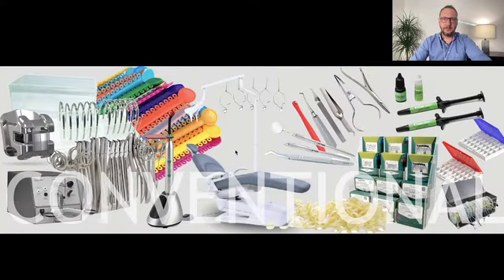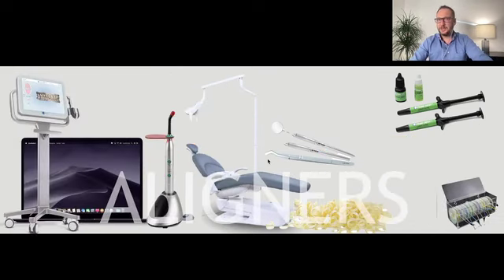My past as an orthodontist was like this for my first appointment. I had a lot of material over the table. I needed my bands, braces, brackets, wires, elastics, a lot of pliers, a lot of machinery, and my office was packed with material. One big change with aligners is that nowadays it clears a lot of space for me.